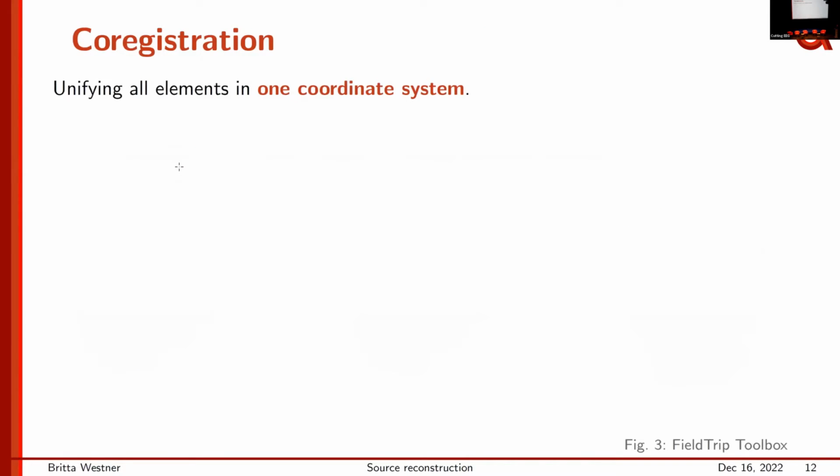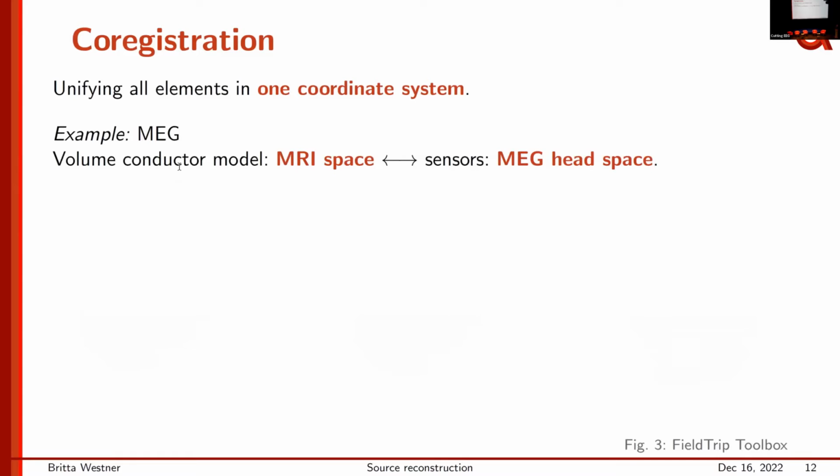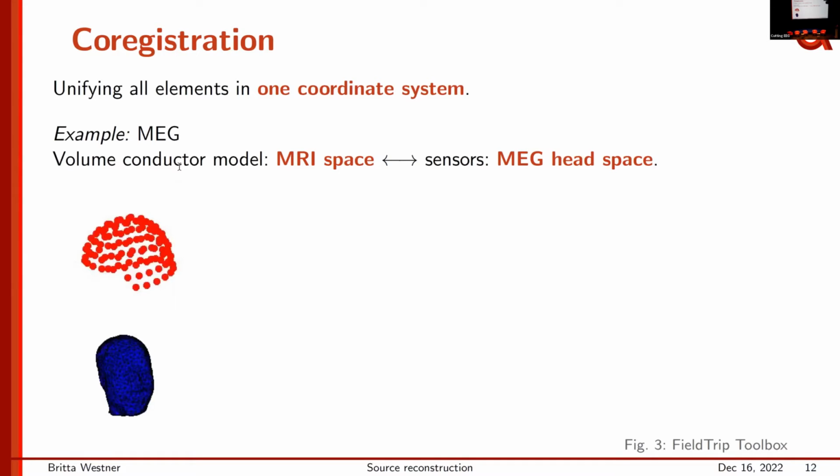But now, very obviously, our MEG was not in the MRI coordinate system because you can't really put an MEG in the MRI. So it has its own coordinate system, the MEG room. And if you would just plot them together, it might look something like this. So you can put them in one picture, but the MRI coordinate system and the MEG coordinate system, they don't magically align.